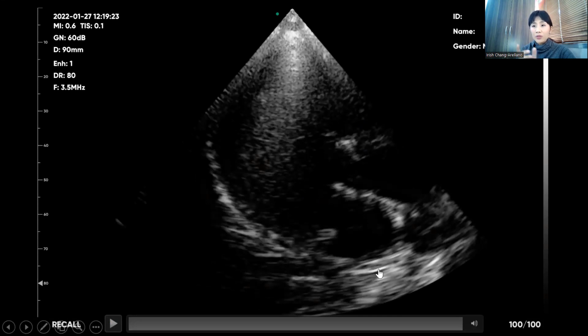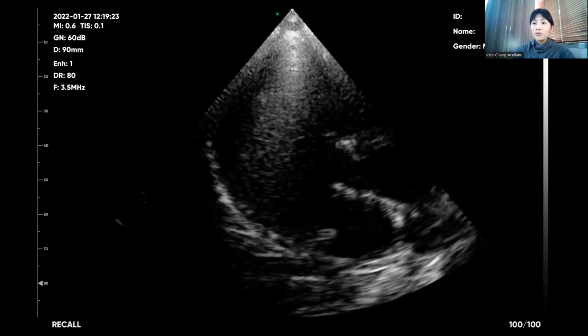And when you use the probe, sometimes when you use the cardiac preset, and then you have to center it here, being that you somehow change it to the phased array. And then you hear an audible sound. You hear a very high-pitched sound when you do use the cardiac preset. But other than that, it's not bothersome for me.